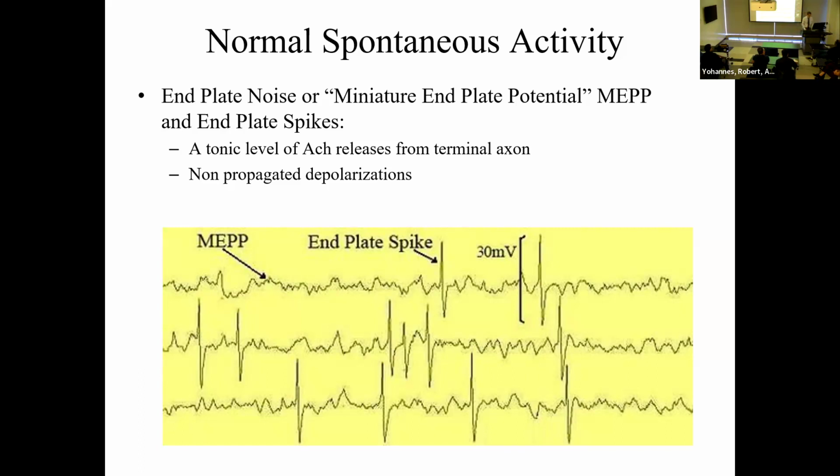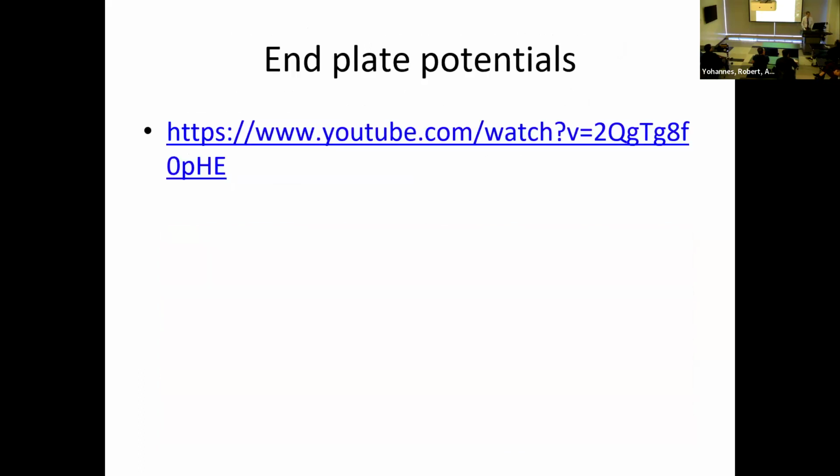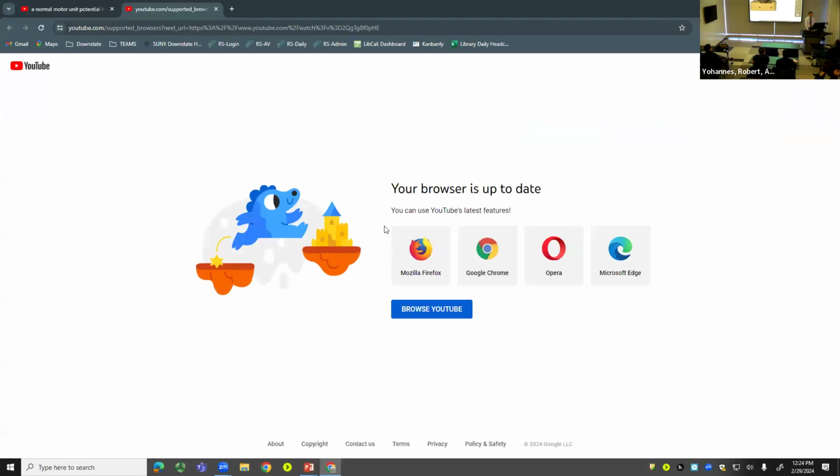And they have a very distinct sound. Everything that we hear, we try to give it a representation in our mind so it's easy to remember. It sounds like waves on seashells, so look for the waves on seashells. By the way, it hurts the patient when you go there with a needle. That's one of the ways to know that's where you are, because they'll complain. So you just pull the needle away, and then they feel more comfortable. So let's see if this works.